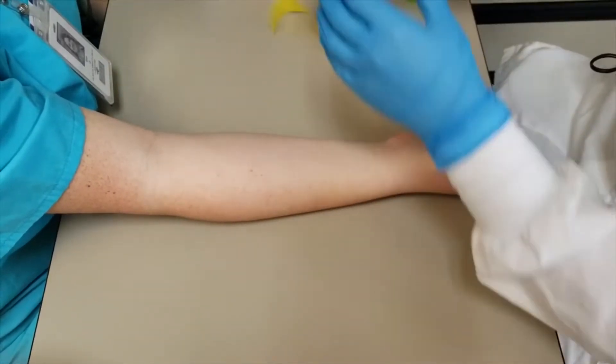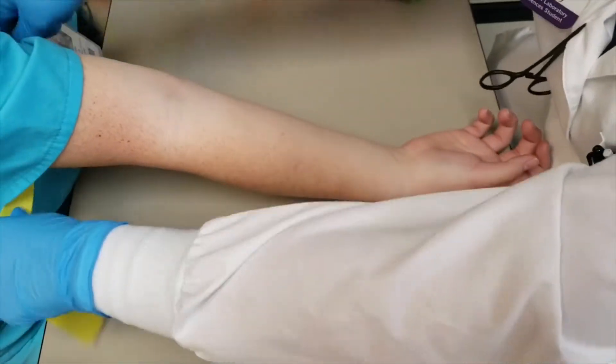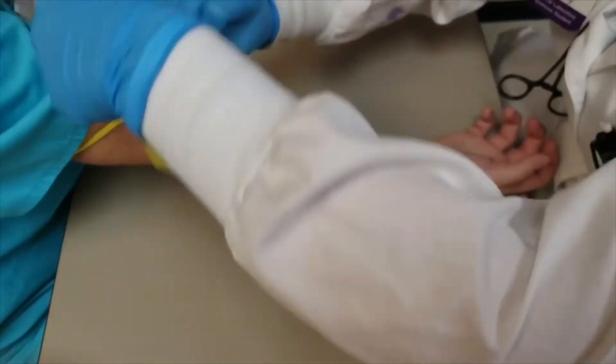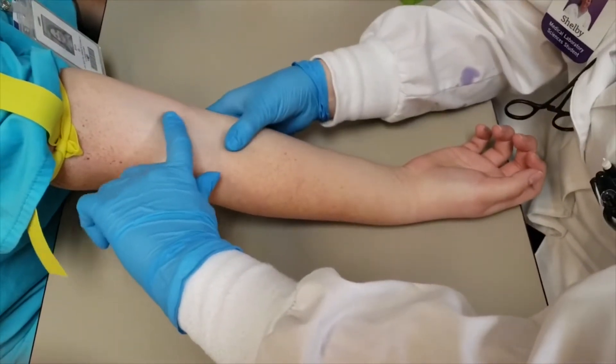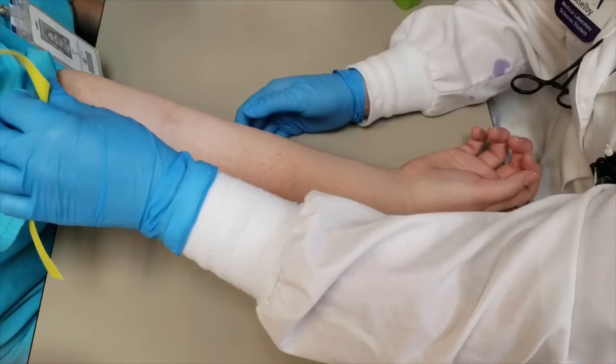First things first, you're going to put the tourniquet on, and you're going to find the vein. So you're going to feel around for a vein. Once you've found a good vein, then you can start preparing for the phlebotomy.